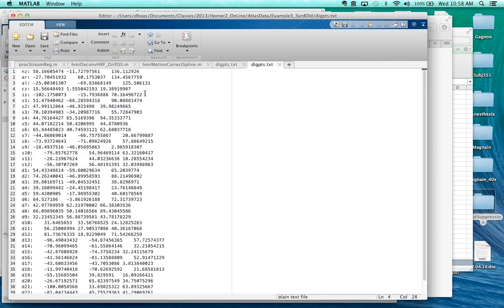There's the text file. These reference points and those coordinates define the coordinate system. So the atlas is actually transformed into that coordinate system. Sorry if that's confusing. You can email me afterwards and maybe I can try to explain it more. Okay, no, that's great. Thanks.